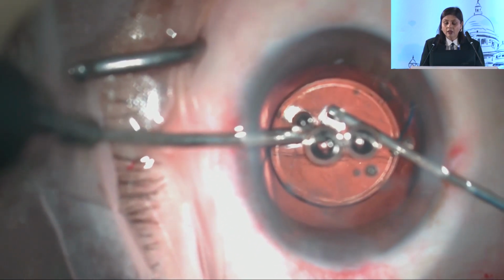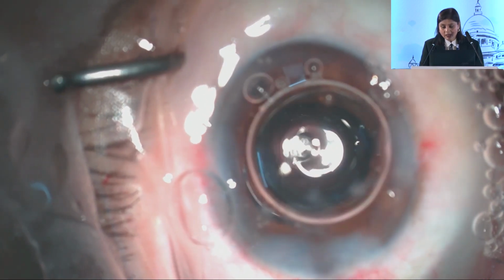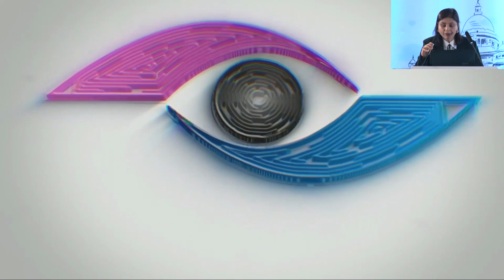And then we use the vitrectomy cutter to remove all of the residual viscoelastic and seal the incision. I have injected some pilocarpine towards the end to ensure there is no vitreous in the anterior chamber. Thank you.